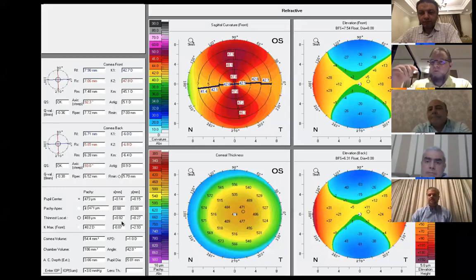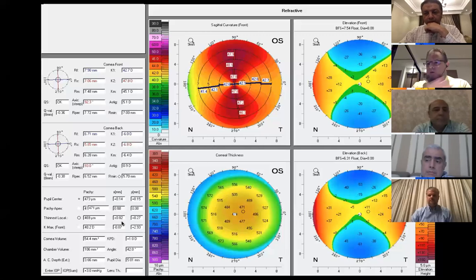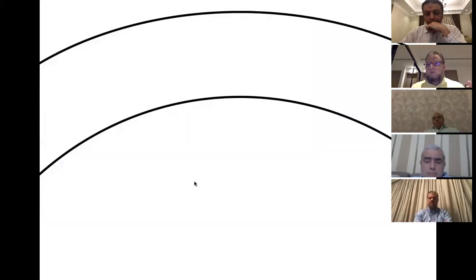Very, very good question. Actually, before taking the questions from the audience, let me go into steps in the same case, because I'm going to highlight all issues. So the first issue is the smile, because some colleagues may go for smile even in these cases, assuming that the laws of thickness of PRK apply for smile, not LASIK for smile. So the least amount of thickness is 470 to go for smile. For example, if the cornea is 480, they go for smile.